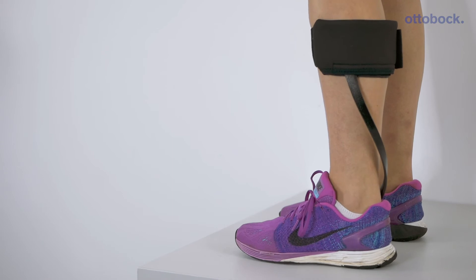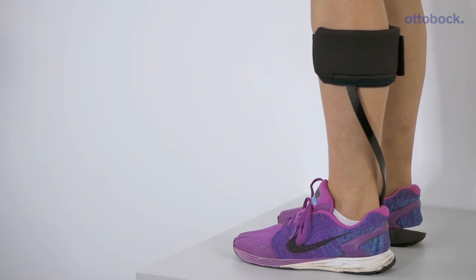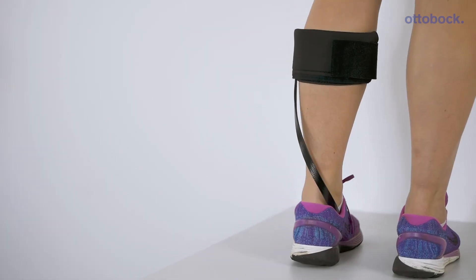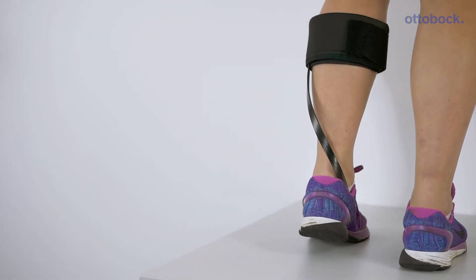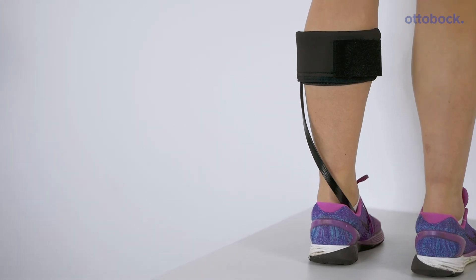The walk-on flex and walk-on trimmable — both of these braces can be used for forefoot loading when climbing stairs or crouching. The full range features a trimmable foot plate and temperature-regulating outlast material on the calf and shin pad. This improves skin hygiene and user comfort.